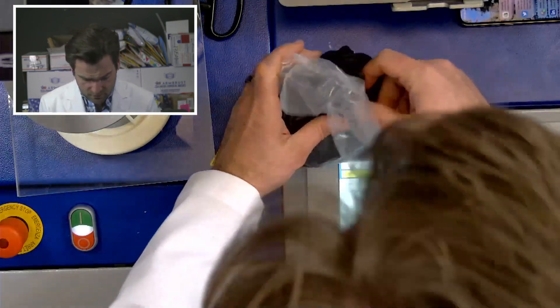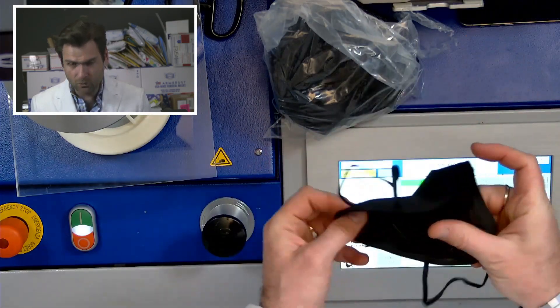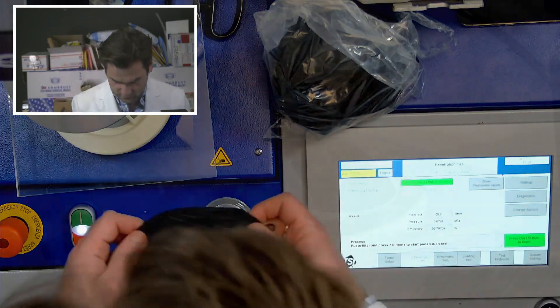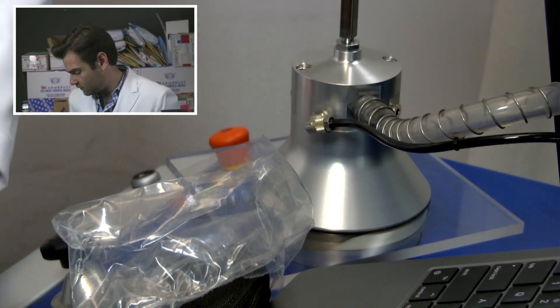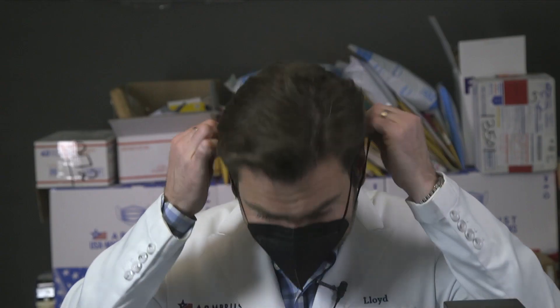Let's open this up, get it in the clamper, and then we'll talk about this weird mask. Alright, let's get it going — we are testing. Let's try this thing on.